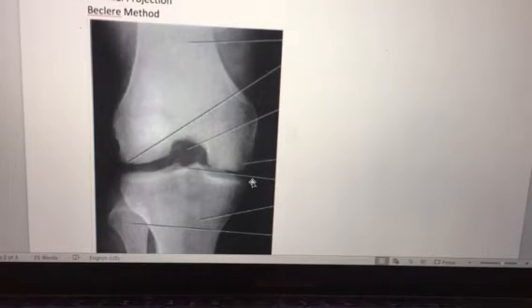You would want open intercondylar fossa, the posterior surface of the femoral condyles. You want the intercondylar eminence and knee joint space, and no superimposition of the fossa by the apex of the patella, and no rotation as demonstrated by the slight tibial-fibular overlap. And that would be all. You would also want your leg to be flexed 60 degrees.